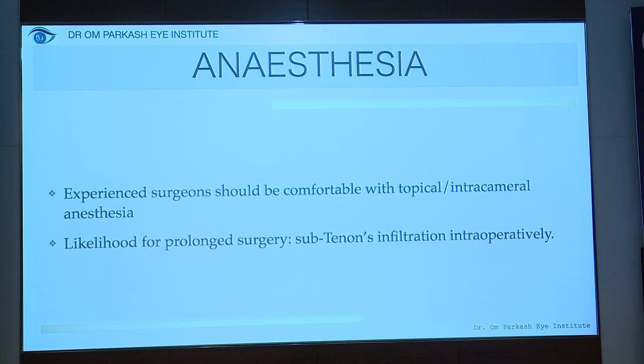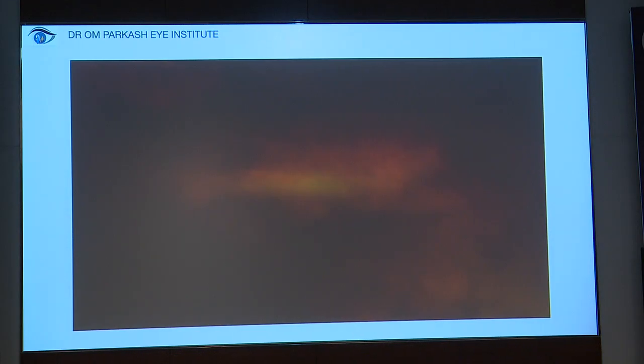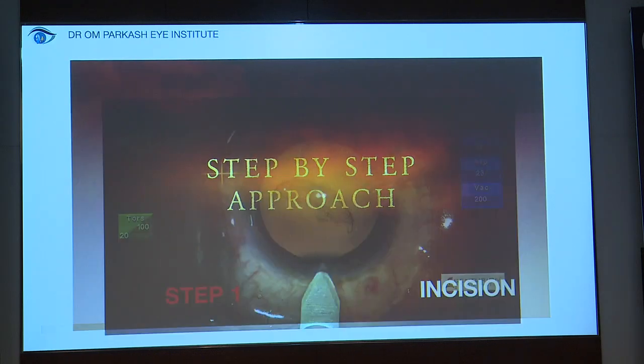As far as the anesthesia is concerned, it's all surgeon's choice, what you are comfortable with. People like me at times mostly go in for topical anesthesia, but if you feel that there's a likelihood for a prolonged surgery, subtenon infiltration can also be done. So let's go into things step by step.